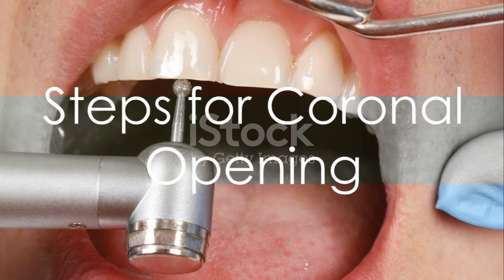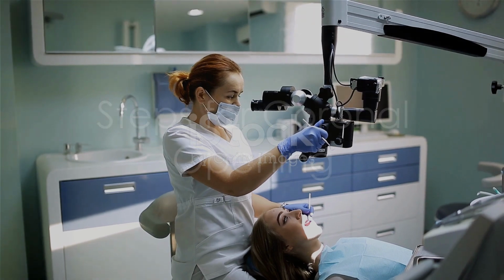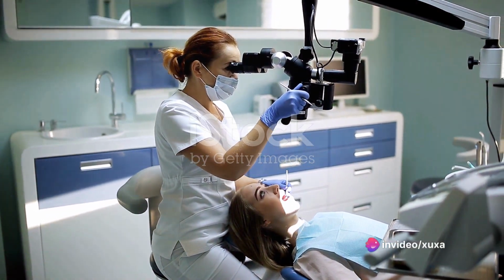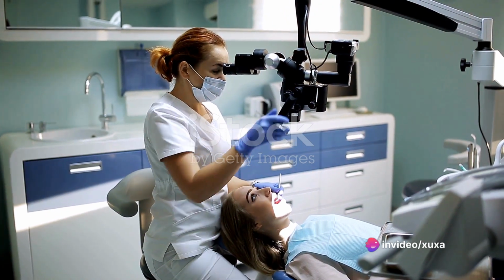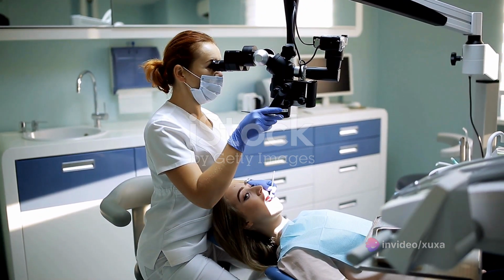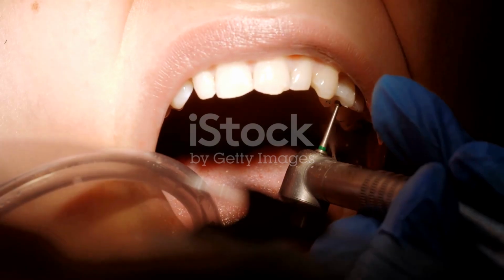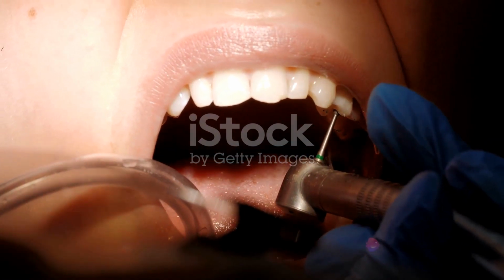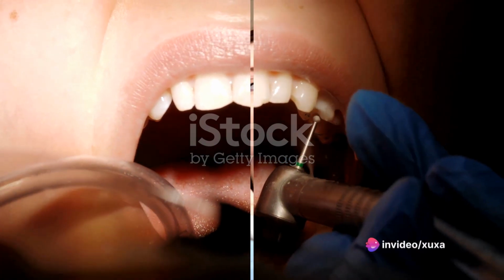The operational steps of coronal opening involve the election point where the opening is started, trephination direction towards the area of the pulp chamber with the most volume, contour shape projecting the tooth's anatomy, convenient shape for a better internal view of the pulp chamber, specific election point for each tooth, and trephination direction creating a penetration tunnel.